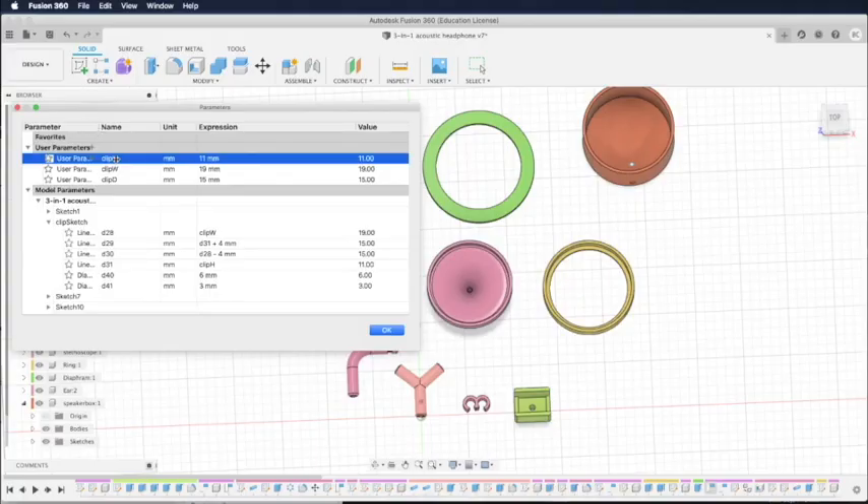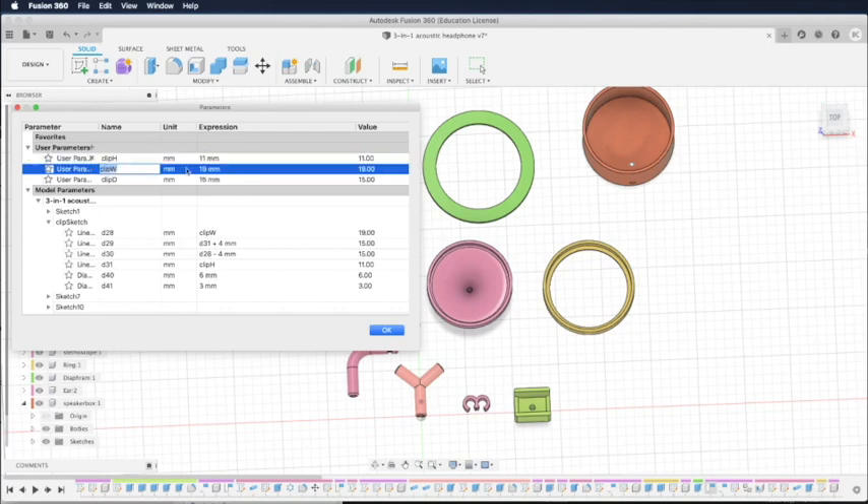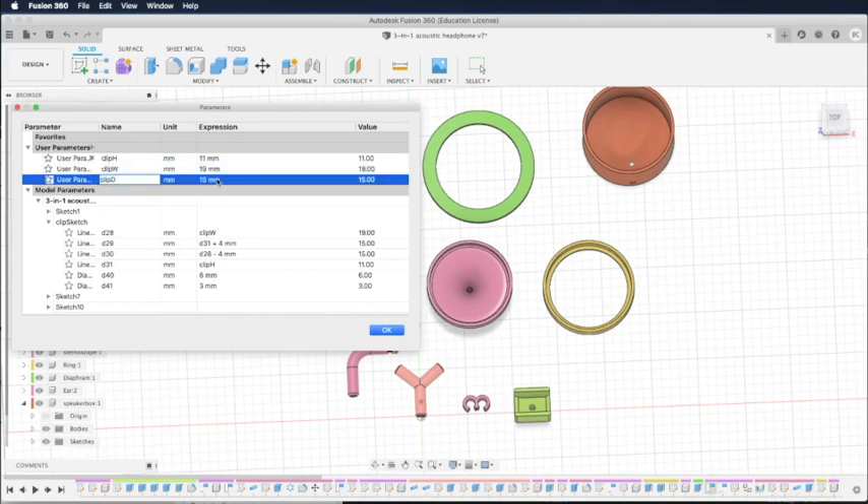To allow the clip to fit different sizes of smartphones, I've created user-defined parameters in Fusion 360. So you can just put in the thickness of your phone: 11 millimeters for the iPhone 11 with a case, 9 millimeters for the iPhone 11 without the case, and 7 millimeters for older phones like the iPhone 6 without the case.